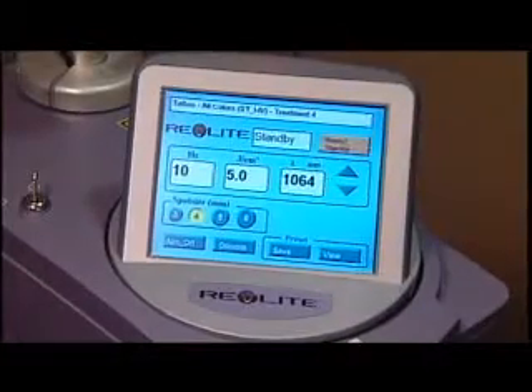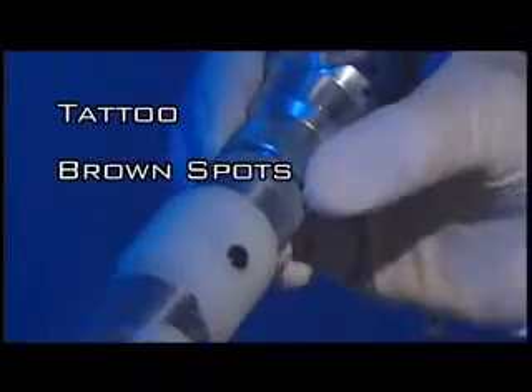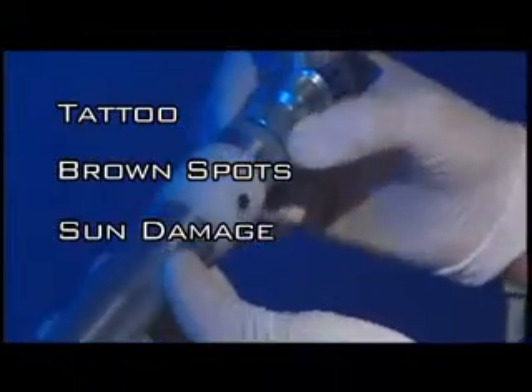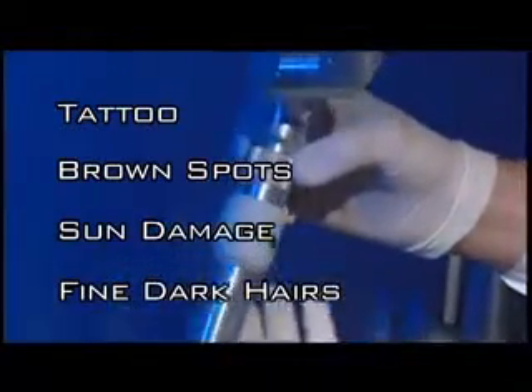When we think about the ideal patient for the Revlite, we think about who's the ideal patient for the cosmetic laser practice — because it could be a tattoo, brown spots, sun damage, or fine dark hairs. It's pretty much everybody that walks into the office.